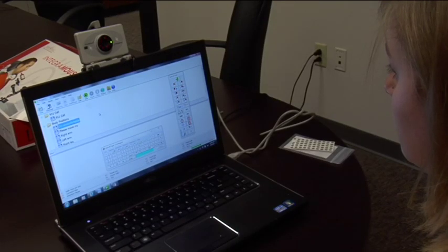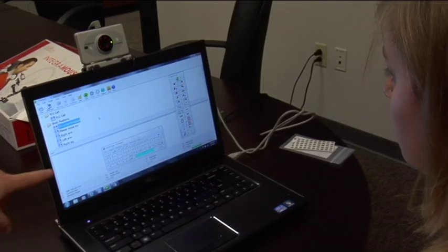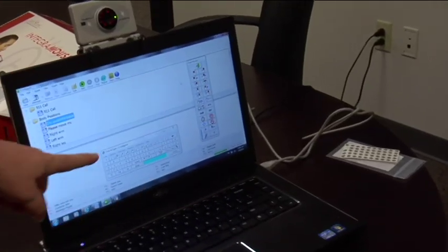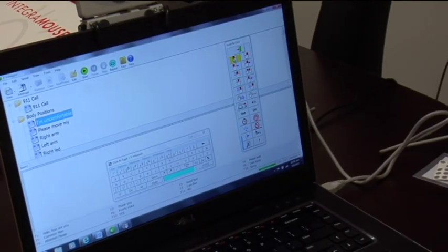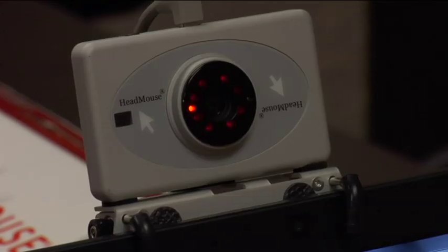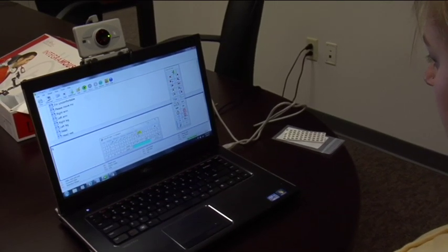Part of our program is to go into a house and set up the head mouse for somebody so it becomes very easy for them to use. This keyboard and mouse control are actually free software programs that can be downloaded onto a computer. We provide the head mouse and resources where people can go on the internet and download this keyboard and the control for no cost.